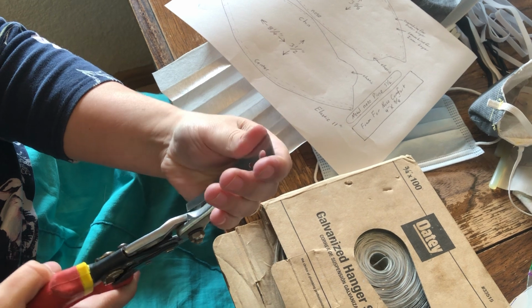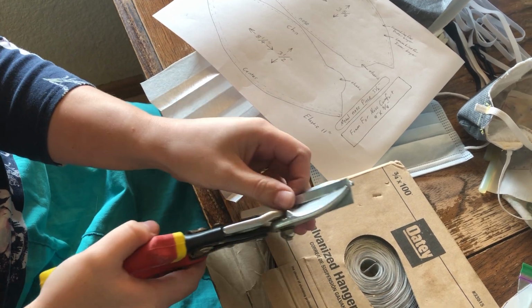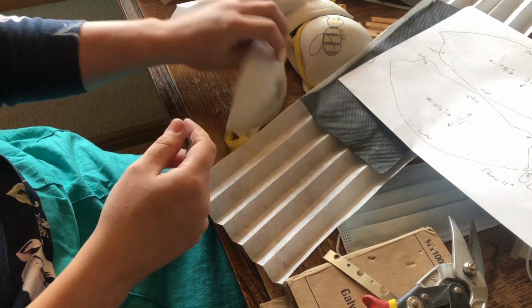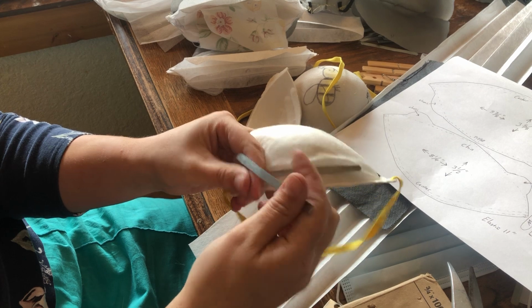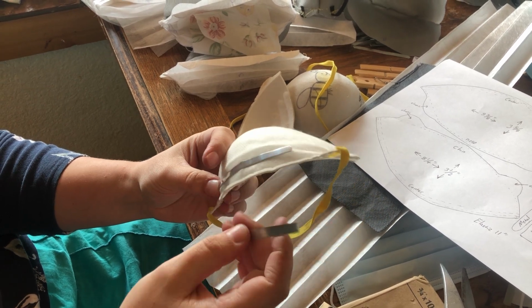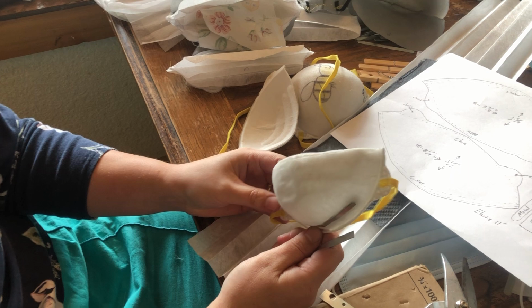I've heard pipe cleaners, different things. Be inventive and do whatever you can. I don't have pipe cleaners. This is what I could find that I had. And if you have access to this, this is working wonderful. This is about the same stiffness as this old N95 that I've got. This is actually a little bit lighter weight than the metal that I've got, but so close to the same you really wouldn't even know the difference. So I'm doing that, rounding off the edges so they're not sharp, and putting that on with hot glue. And that's basically my mask.